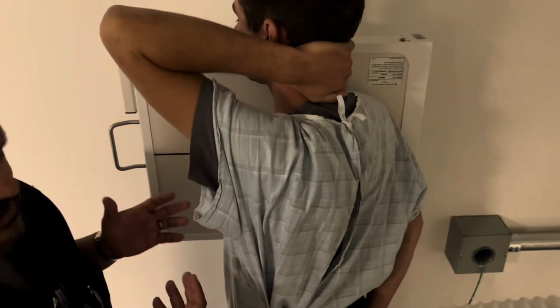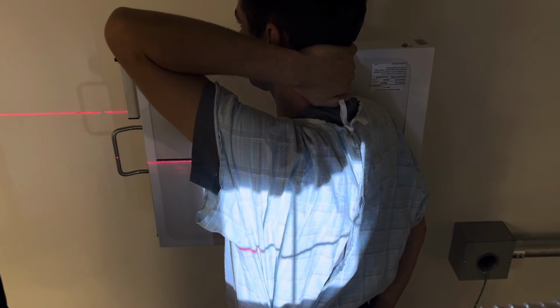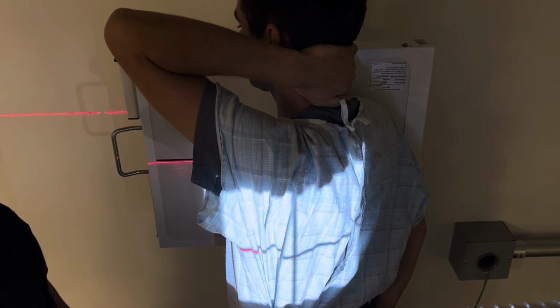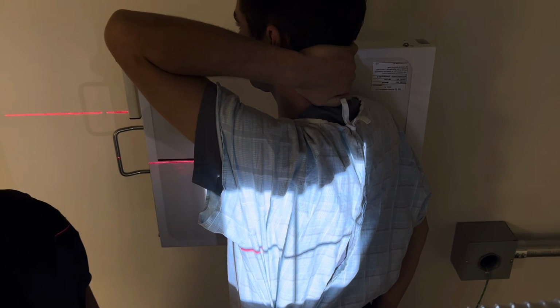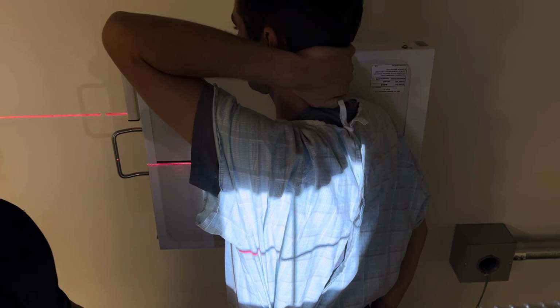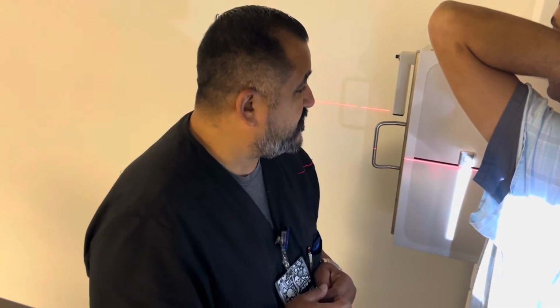But again, you guys, this is going to be your rib exam. So this is for above the diaphragm. What we did today was above the diaphragm for anterior, posterior, and axillary rib injuries. I'm hoping this will help you. We'll do a separate video, you guys, for the lower ribs as well, okay? All right, so I'm hoping this is going to help you. Thank you for the request for this video.